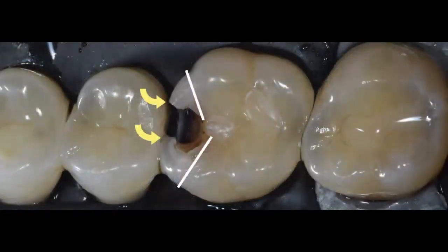Now this is the initial, the preoperative photo of this same case. Now, as you can see, there's an actual cavity in the tooth, and there's a cavitation when the patient presented to our clinic. You can see that there's still some of that proximal wall that I have to remove because it's undermined enamel, beyond these white lines. There's caries, there's decay underneath that enamel, so I'm going to need to remove these portions of the tooth.